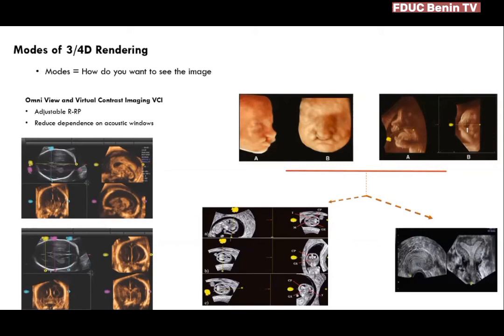And the equipment would render for us the corresponding images, as we can see here, depending on what the observer would want. So in this case, we have this scenario. We also have another scenario where we have multiple observation points, and then we have multiple coronal images.